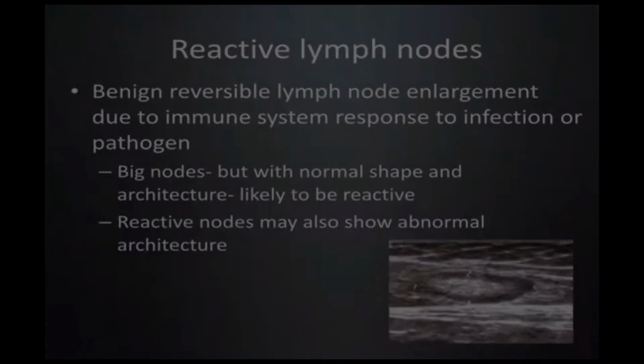However, I would like to say before we go on that while ultrasound is extremely helpful in limiting the differential diagnosis of lymphadenopathy, still it cannot make a pathologic diagnosis. For that, you're either going to need bacterial culture or a fine needle aspirate and a pathologic diagnosis. Ultrasound probes are getting very good and the resolution is great, but still it can't make a pathologic diagnosis.